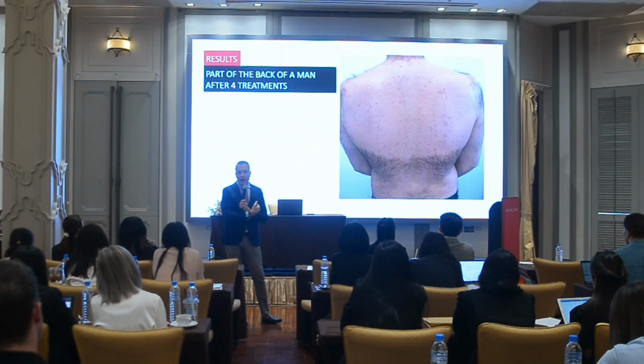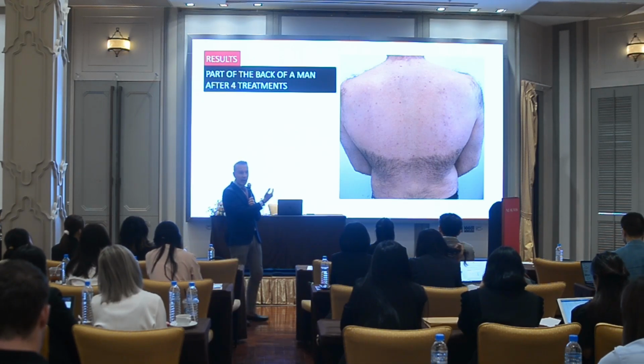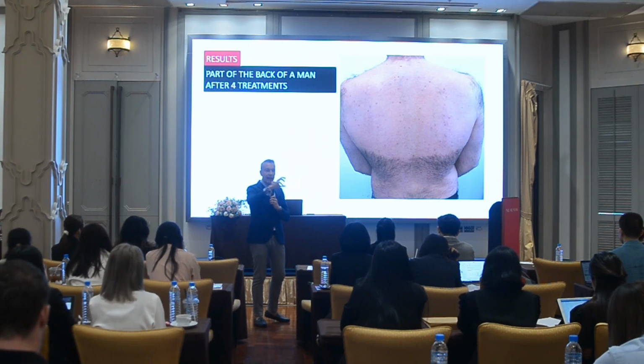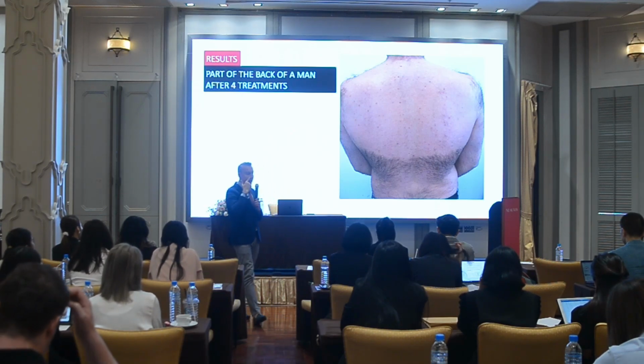2 or 3 treatments in paint mode, because in stamp mode we need hours to treat this guy. So first 2 or 3 treatments with the paint mode, and then where we still have the hair regrowth, we will go with the stamp mode.